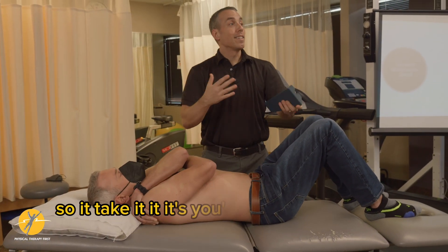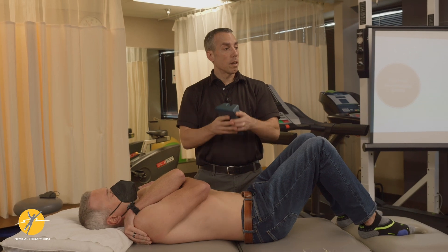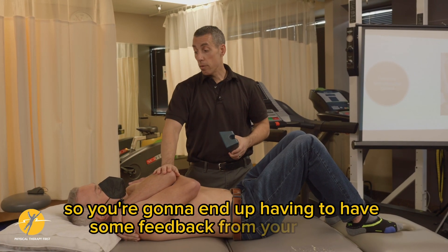So it takes — you're preserving your hand, but you have a little less understanding of what's going on with the system. So you're going to end up having to get some feedback from your patient.